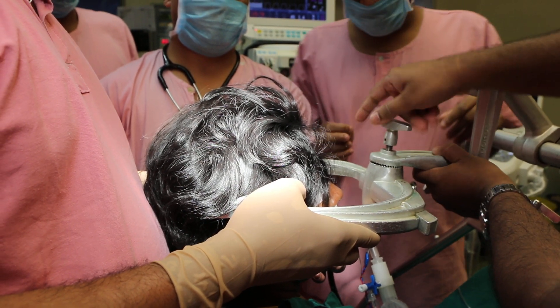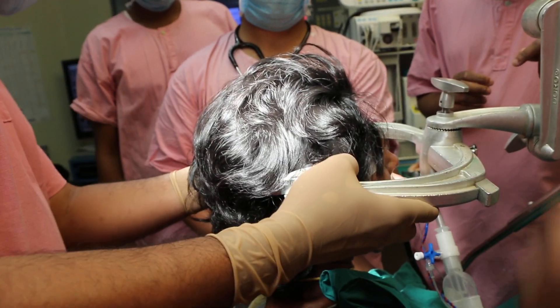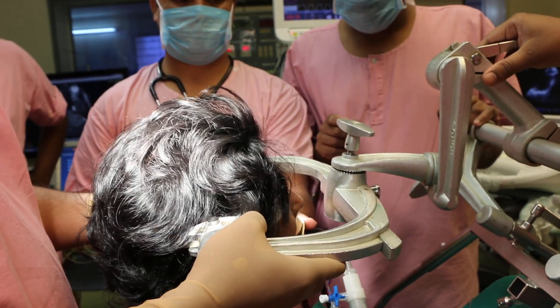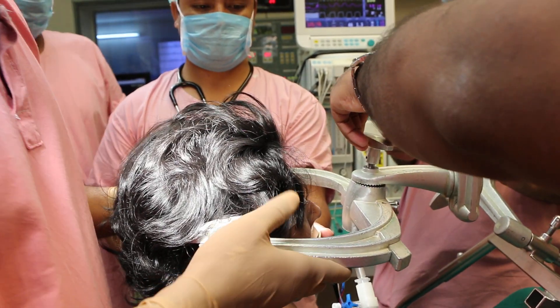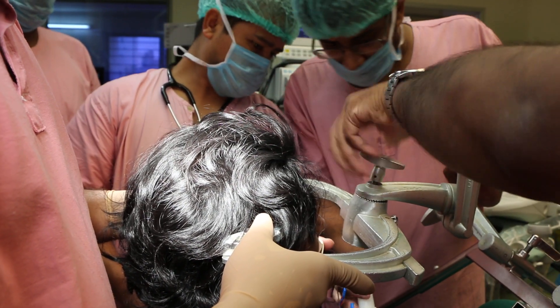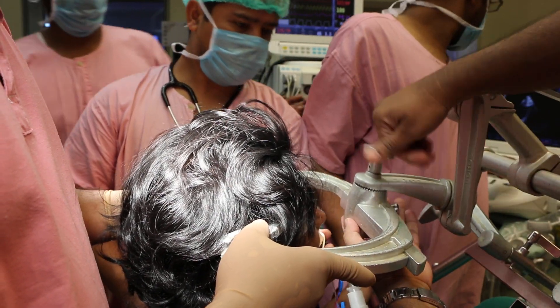Now rotate. And lateral flexion — you need to tilt the head towards the right side so the cerebellum falls away. Okay, fix it off. Let's reassess the whole thing again. He is trying to fix up all the frames.